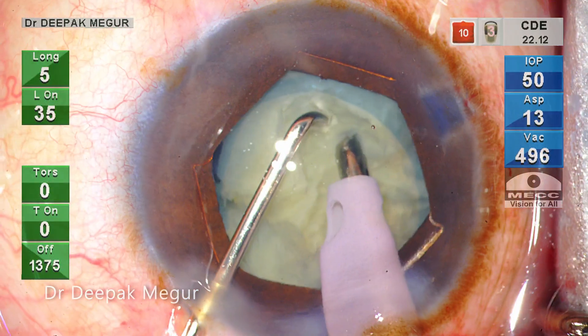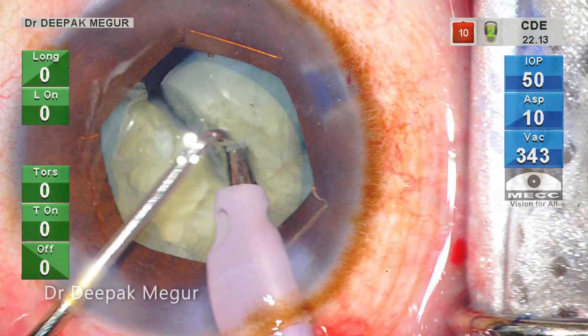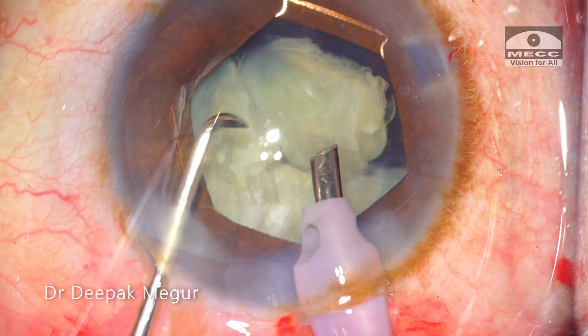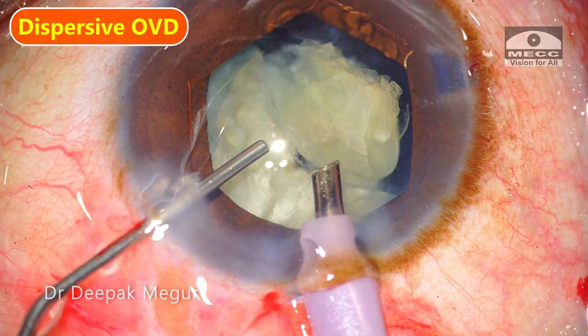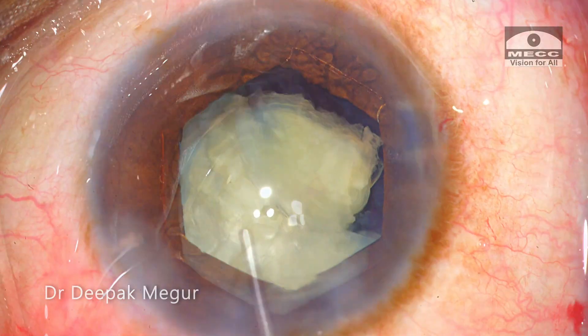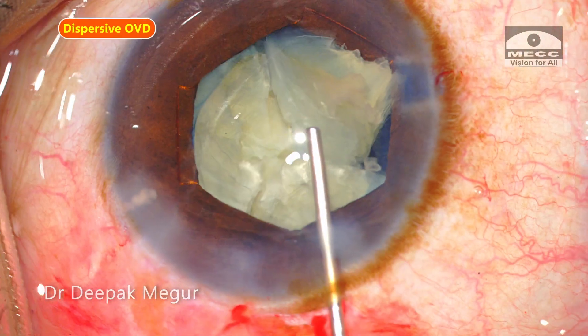The next quadrant is chopped and the fragment is subsequently pulled out of the bag for emulsification. But at this point, I realize that the BSS pouch has emptied and needs to be replaced. Before coming out, I am injecting dispersive OVD through the side port to ensure that the chamber does not shallow.